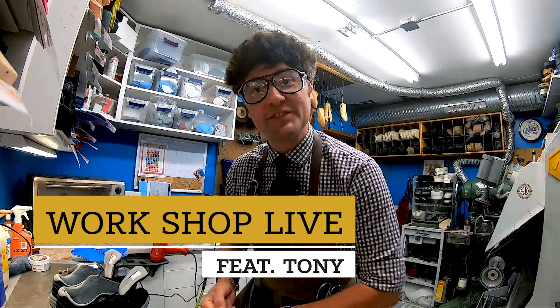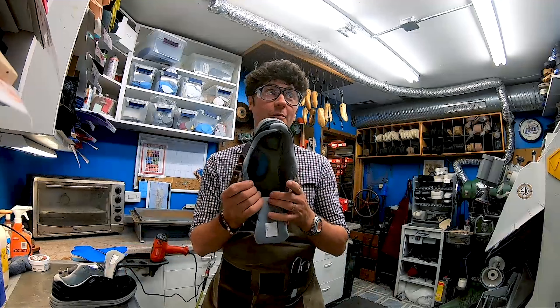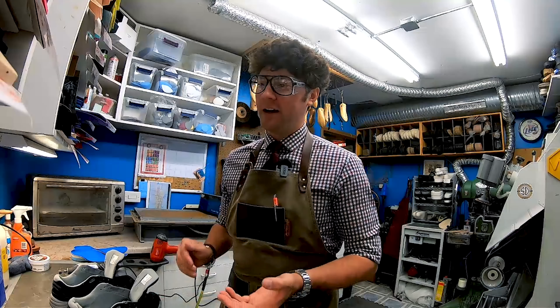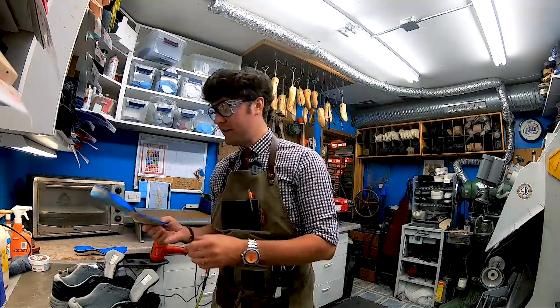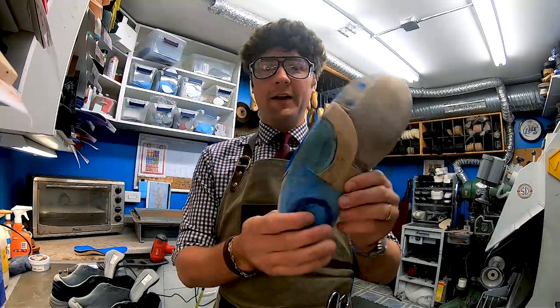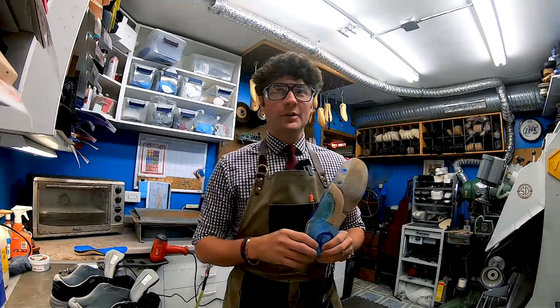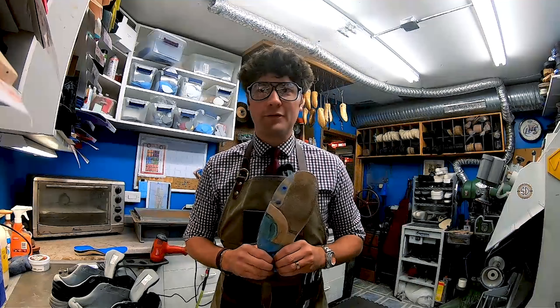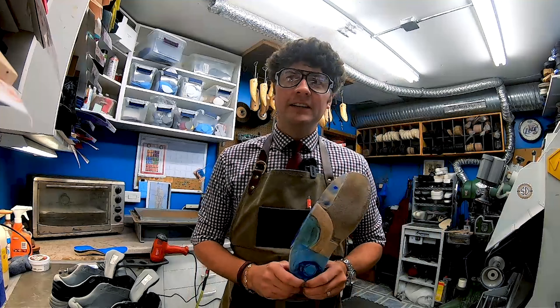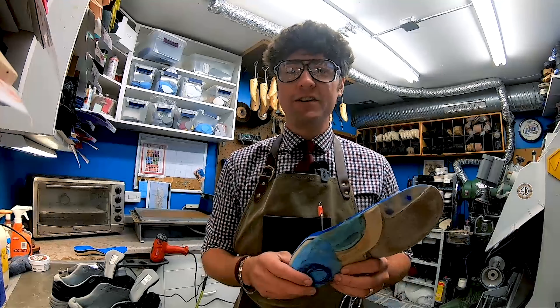This is Workshop Live on a beautiful Saturday here in Wisconsin, and we have a good old-fashioned drill and fill project. This customer has had some terrible ulcerations — she's diabetic and in need of some help for offloading. We have a custom orthotic, and the main culprit is two areas around the cuboid that have deteriorated over the years. She has dealt with ulcerations on and off throughout the last decade, was casted then in a CAM walker for about a year and a half to two years, resulting in really bad tissue deterioration.